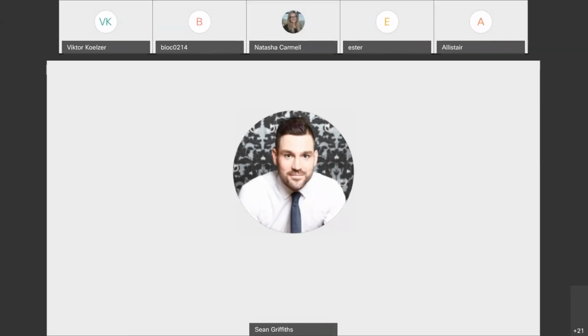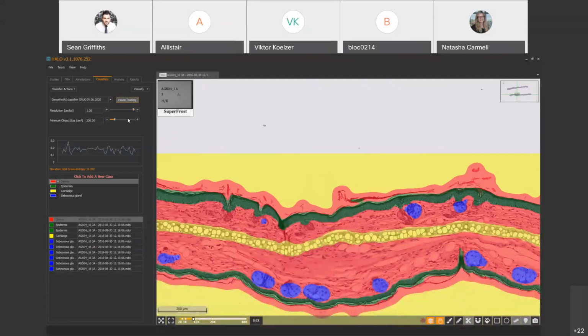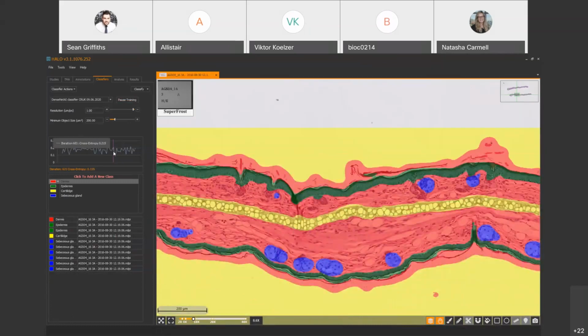So what you can see here is I just opened it, and I had the same image open. I loaded the dense net classifier, and it started with a cross entropy of down here. Okay. So it didn't begin from all the way at 6 or whatever the entropy is when we first started training. So though it said start training, it's building on what it already learnt. You can see that because we're already at this sort of 0.1 level. Yeah, because the graph zooms right in, and when you look at it, you don't realize that you lose the context. Yeah, that's a good point.